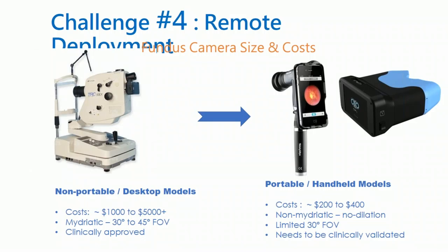one of the criteria, as you saw on the initial slide, was that we wanted to make sure that the solution was portable. So one big constraint, of course, is you can't take this large, bulky equipment into the field. So we have to come up with a way to do this image capture using a portable device. Smartphone cameras have better resolution than some of these fundus camera images, but they're not yet clinically approved. So one of the challenges we're also trying to solve is to create a smartphone-based device, which is handheld and costs a couple of hundred dollars. We're working on a prototype to be able to do that. Hopefully that should be ready for the next meeting.